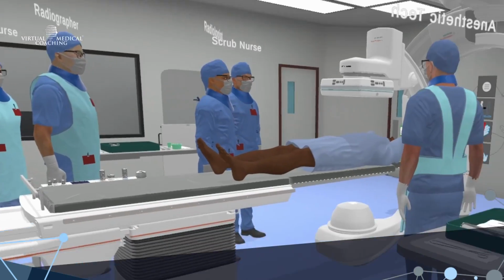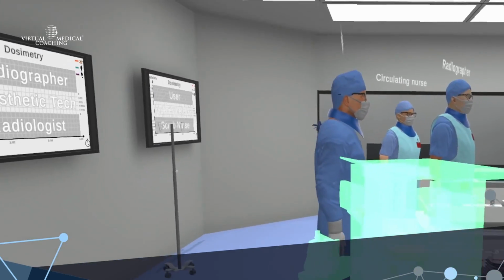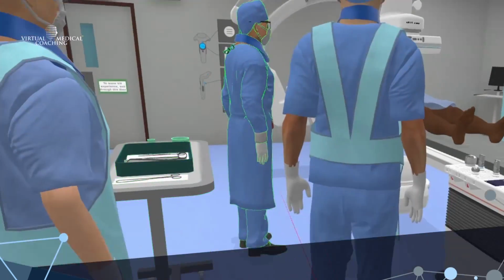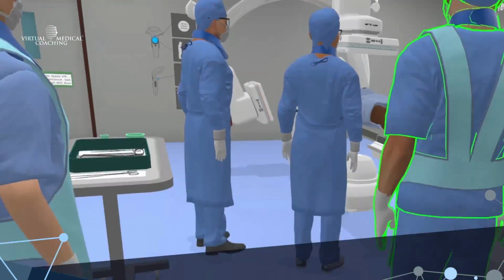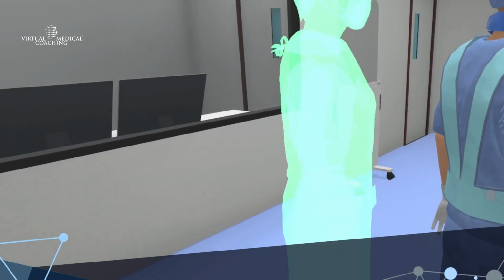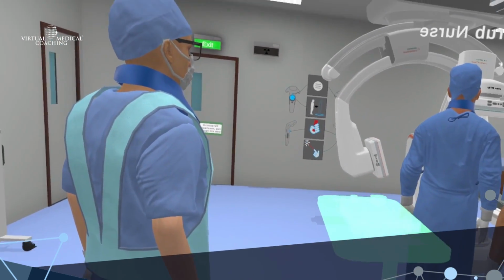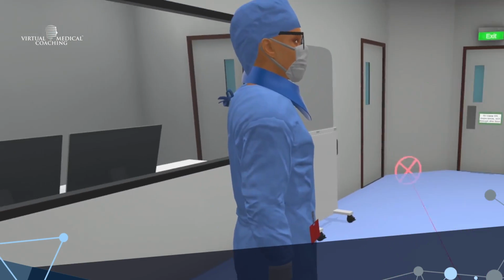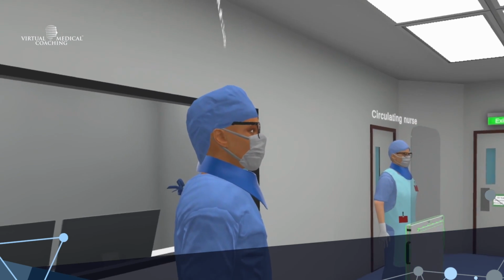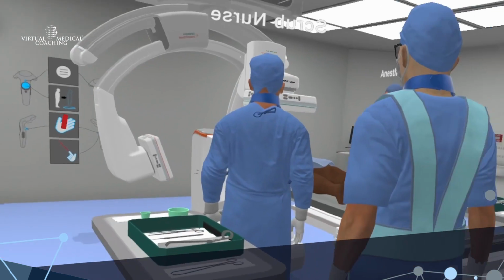So we've got a patient on the table, and like I talked about, the surgical trolley going around. Move the radiographer. He's a big, intimidating guy. I move him down by the end of the trolley, the end of the bed. So there's a little bit of time, and I'm going to put a shield in front of him. The radiologist, she goes somewhere else in the room.